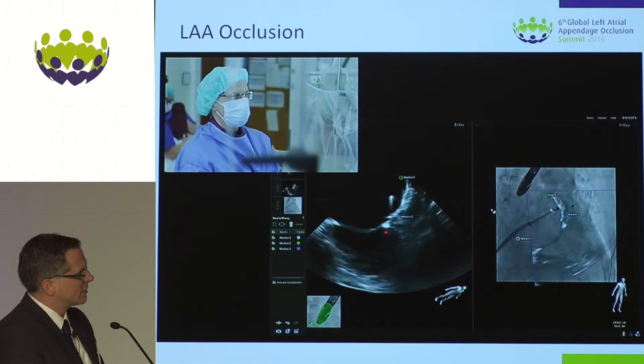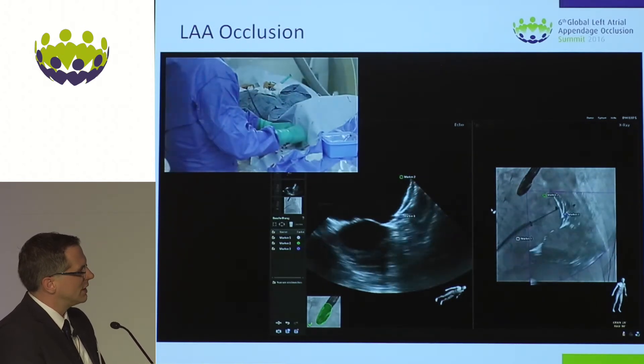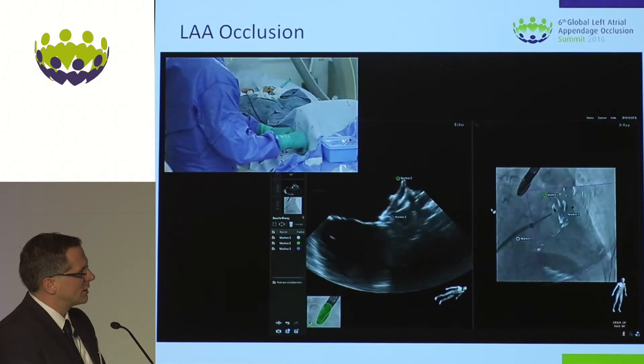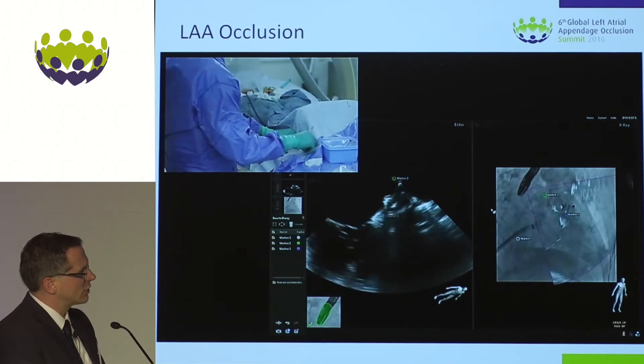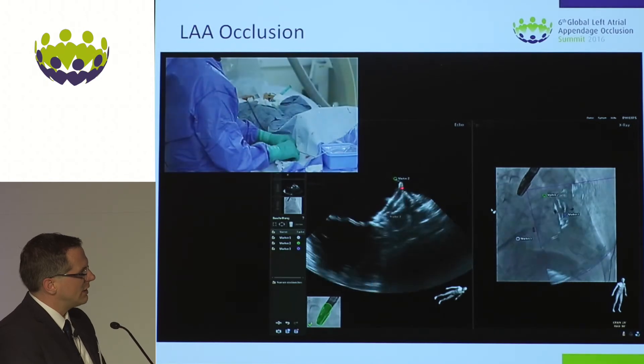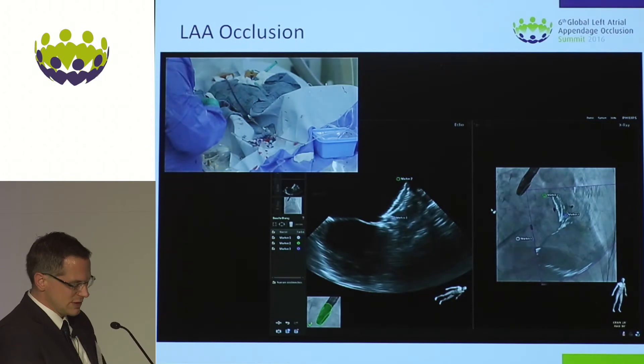We see again that the circumflex and the lobe in the 45-degree position gives us a good and stable left atrial appendage occluder in place. Even with this large ridge, I think we have achieved a very good position at the upper part concerning the warfarin ridge.